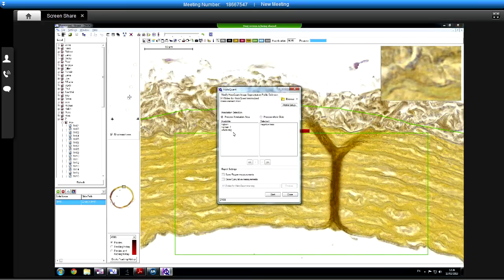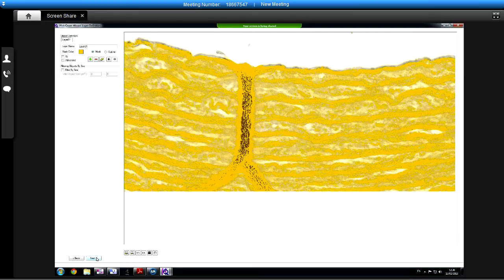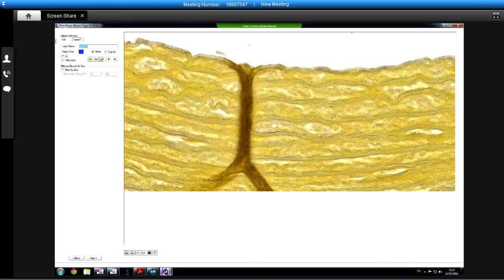Right, I'll tell you what we'll do. We'll just do this as a second layer in the same one, because then we can compare. So that's what it's detecting in the existing one. That was supposed to be red. This one will make yellow. In this case, it's going to be everything apart from the white background, isn't it? What are these dark bits here? Is that a fold? Okay.